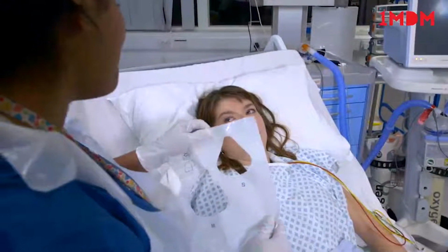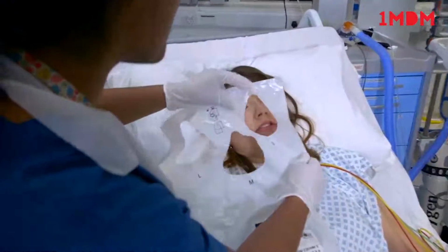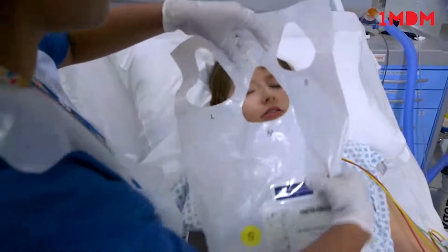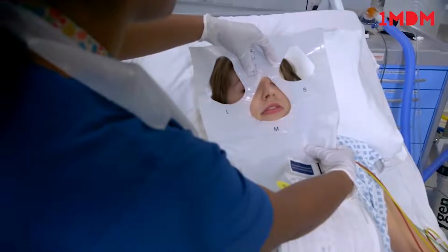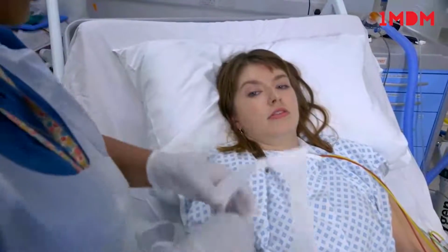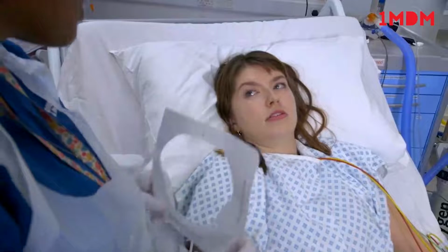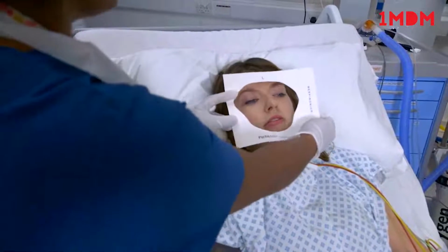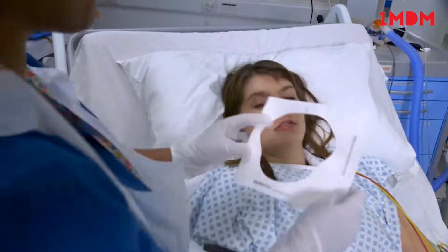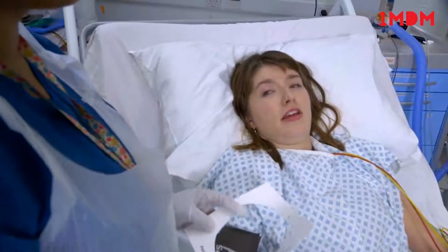So I'm just going to size up which is the most appropriate. We'll do the face mask first. I think this looks a bit smaller. I think probably the medium would be the most appropriate. I would also want to check the full face because this is more comfortable. I think a full face, large one should be most appropriate for you. Okay? Are you happy? Yeah.